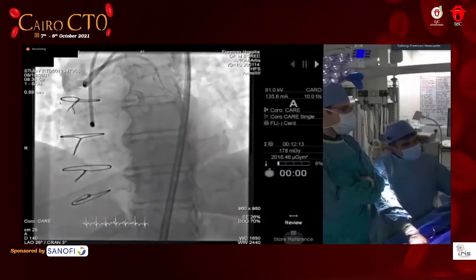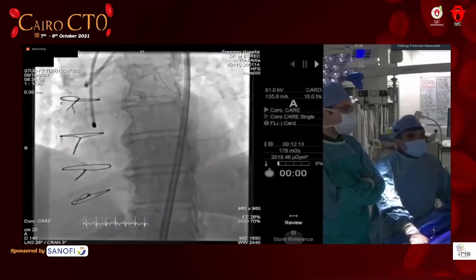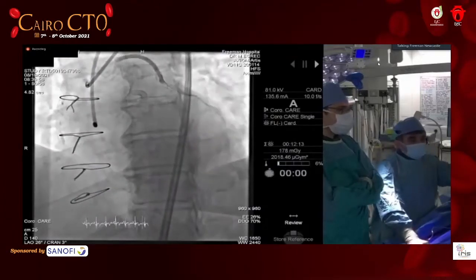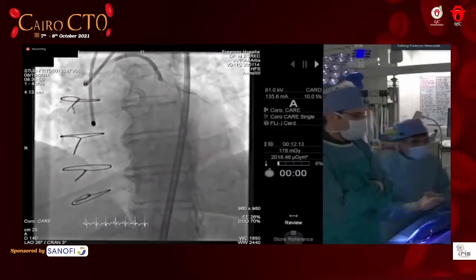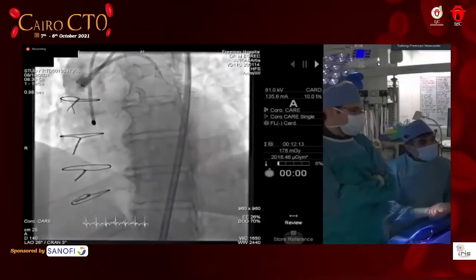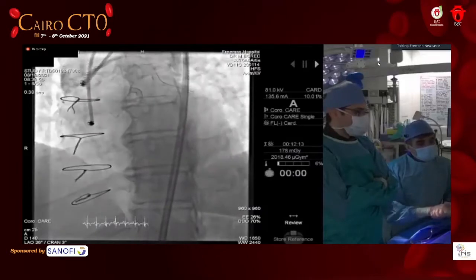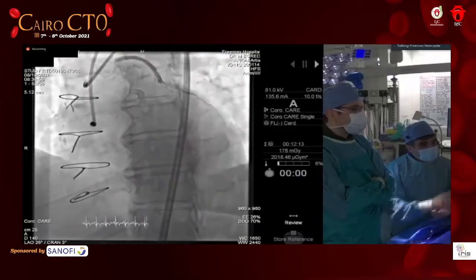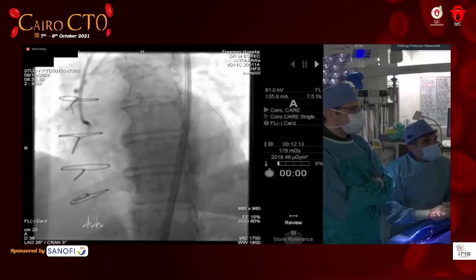So this is in September, about 3 weeks ago. This vein graft to the OM was completely open with collaterals to the right. Obviously today, my plan was to go through this vein graft, open the PDA, then go through the vein graft to the right and open the LV branch and coil both grafts. However, you could see the first shot here changed the whole plan because the vein graft between September and now has thrombosed. Can you see the thrombus in there? Yeah. So anyway, we might go forward. All I did, I just took an aspiration catheter and aspirated that. You could see it coming in, up and down.